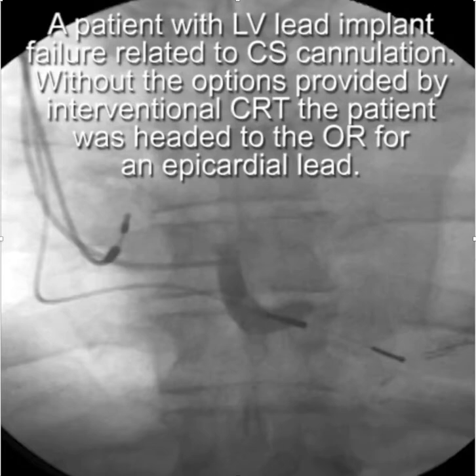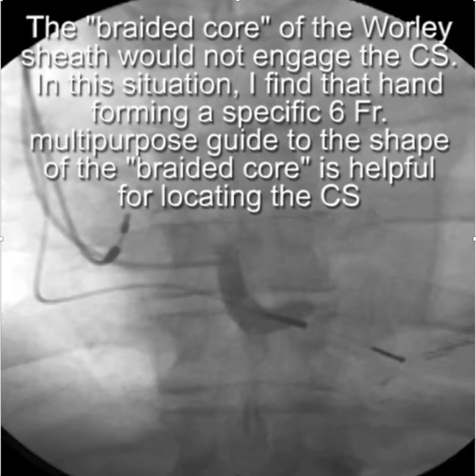This video is on the use of the anchor balloon technique for coronary sinus cannulation. This is a patient that had a previously failed attempt at CS cannulation and LV lead placement.